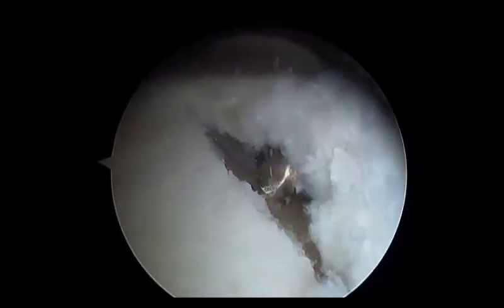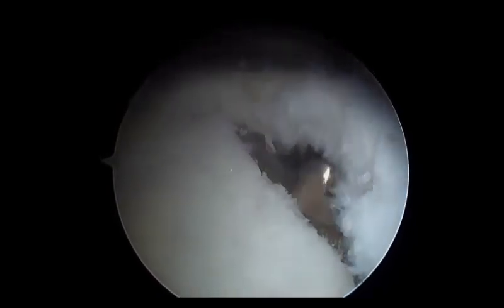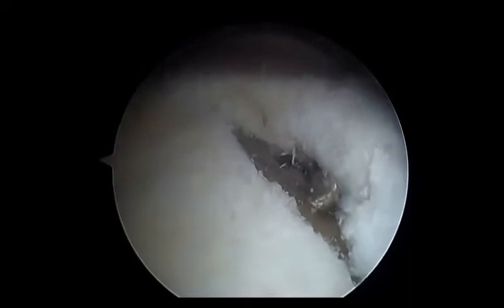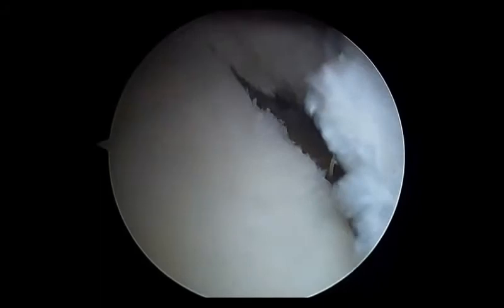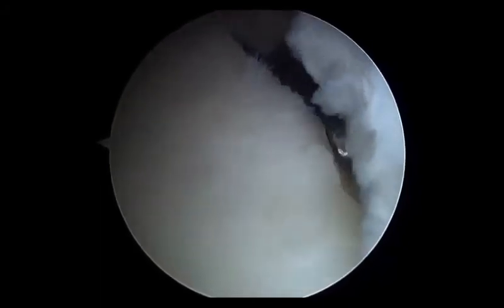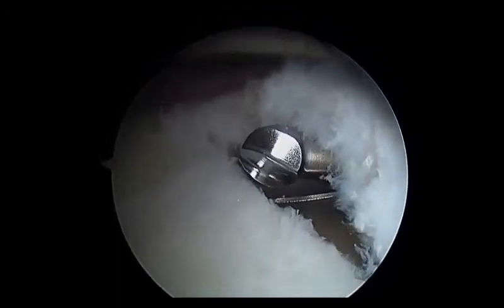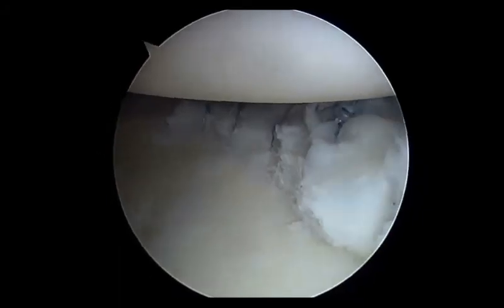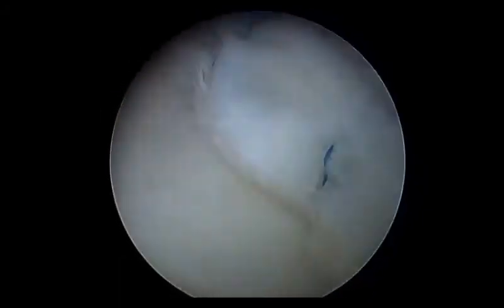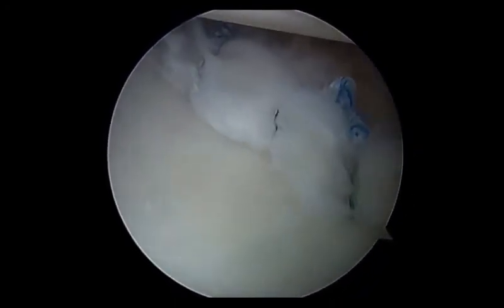A hooded burr can also be introduced to achieve similar goals. Once adequate preparation is completed, the posterior labral tear can then be repaired.